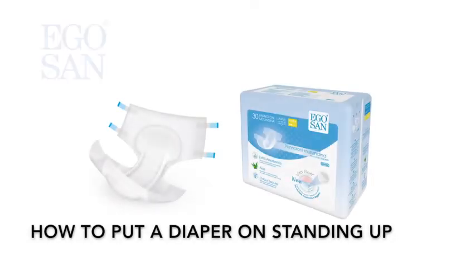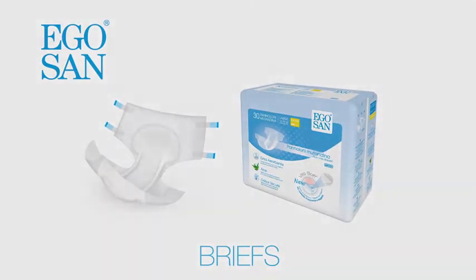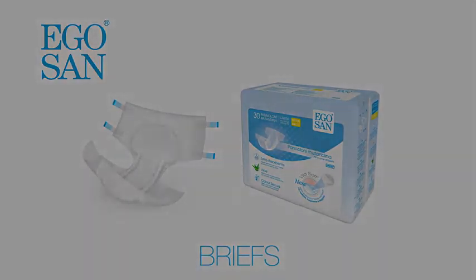This video describes how to put on EgoSan briefs in a standing position. Make sure you have chosen the right size and that the absorbency is suitable for your incontinence level.